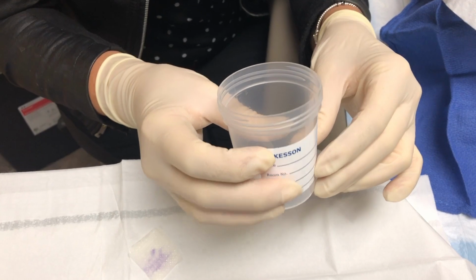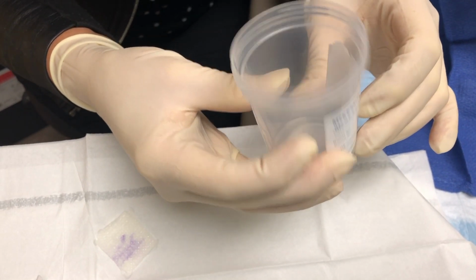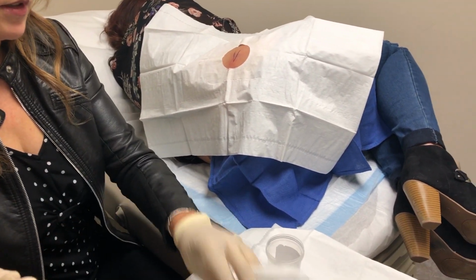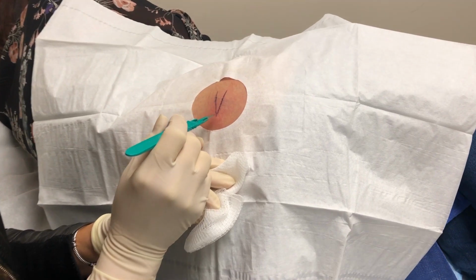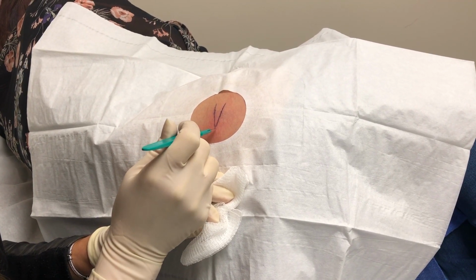So this patient is getting a 100 milligram testosterone pellet, and you can see it's about the size of a grain of rice. And we're just going to test that area to make sure that it's numbed up. Anything sharp here, Lynn? Mm-mm. Nothing? Okay, gonna feel some pressure.